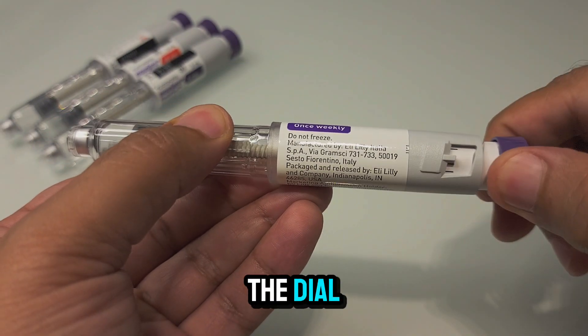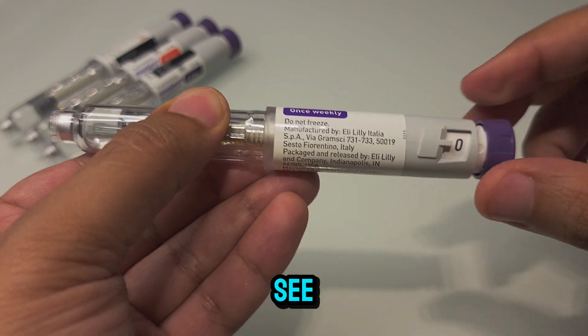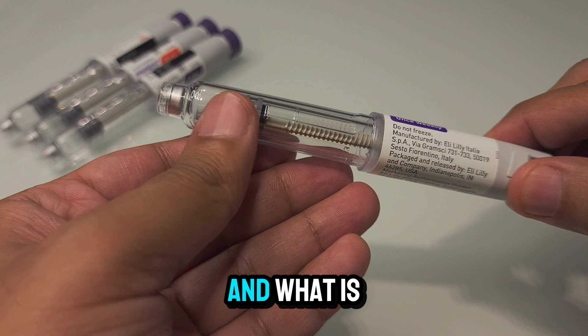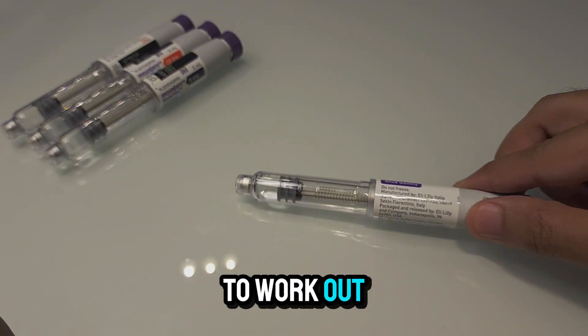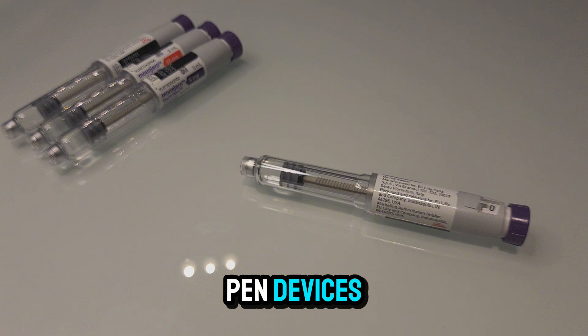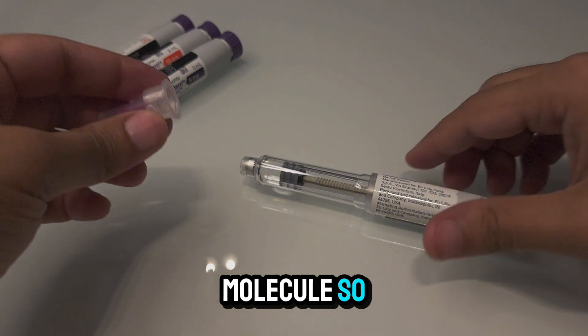I can see that the dial does not go back further. Today I'm going to see how far we can push it, what happens if force is applied, and what is the volume of this residual fluid — in order to work out the degree of waste we are having from Mounjaro pen devices with regards to this essential molecule.